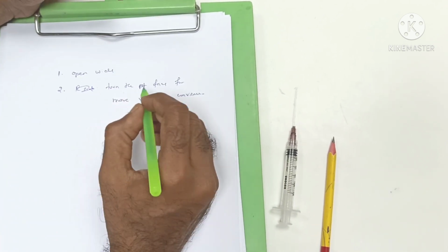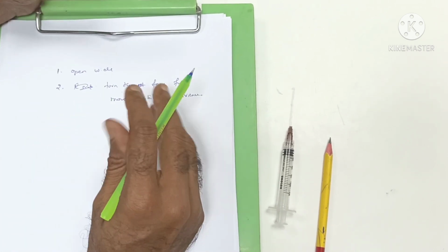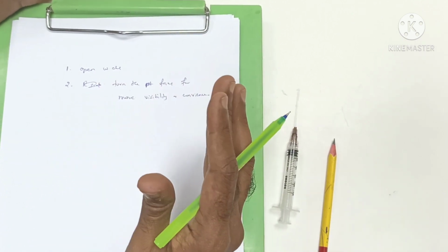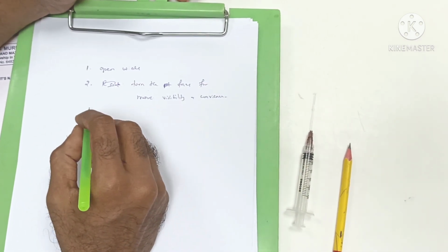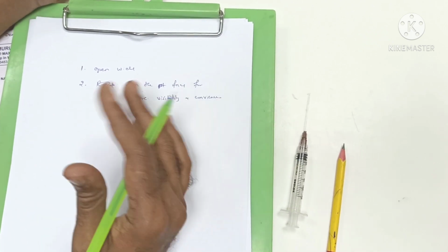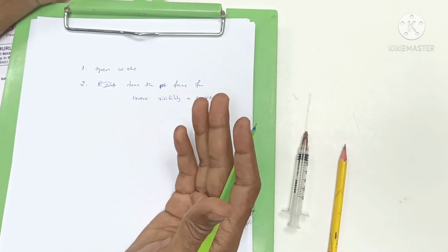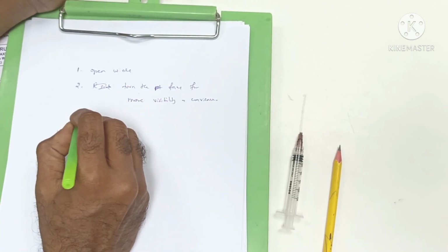Okay, so this is one important point which I forgot to tell. First, ask the patient to open wide. Next, ask the patient to turn to a more favorable position. That depends on whether you are giving a right side or left side block. If you are giving a right side block, ask the patient to turn to your side, or if you are giving a left side block, the patient should face away from you.